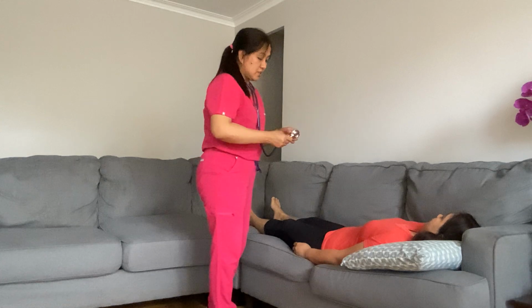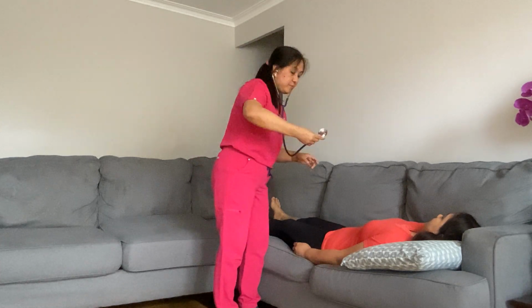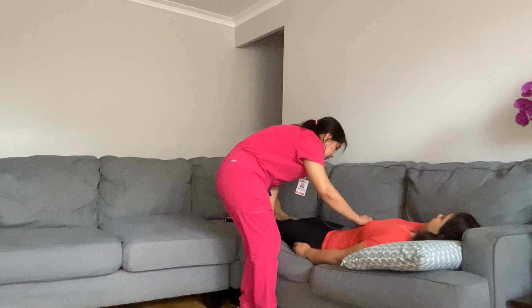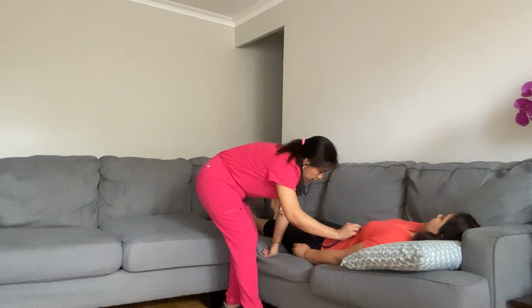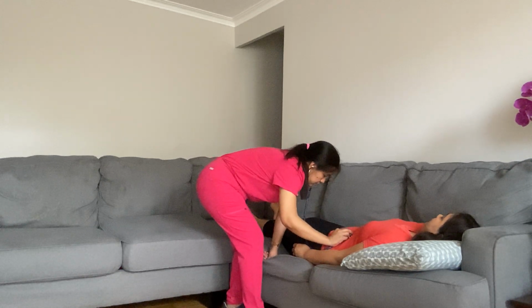So now I will auscultate the bowel sounds of the abdomen on the 4 quadrants. So by starting in the right lower quadrant, then going up to the right upper quadrant, then transverse to the left upper quadrant, then going down to the left lower quadrant.